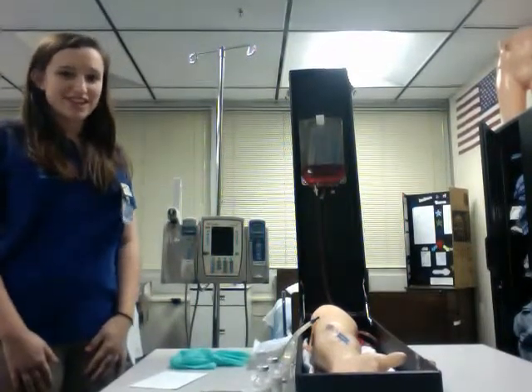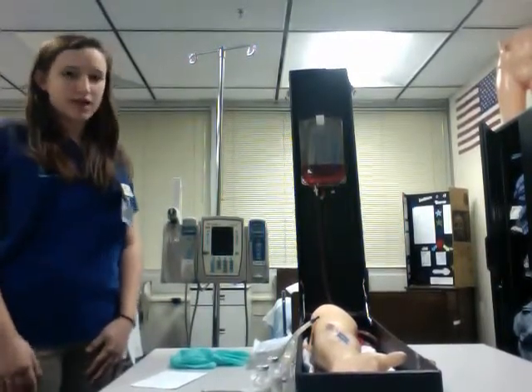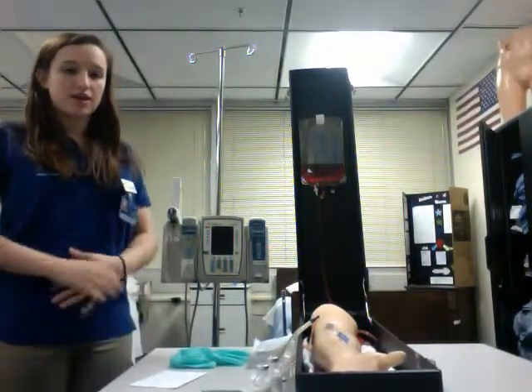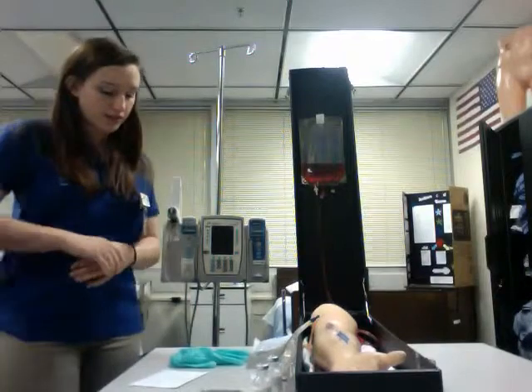Hi, my name is Anich. I'm an FSTJ nursing student. I'm in term 2 and section 5. Today I'm going to be hanging a Minibag for an IV.